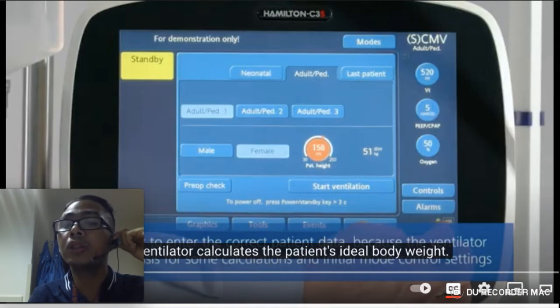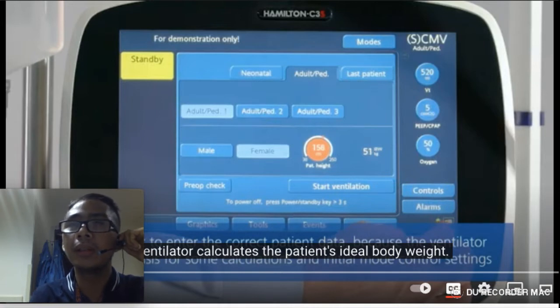When you enter it in this ventilator, it seems to be programmed for a normal patient only. As a default, the microprocessor of the ventilator will compute the tidal volume using the first statement, which is for a normal patient. So you could make further damage to the patient. It is okay only if the patient hooked to the ventilator is under normal condition.